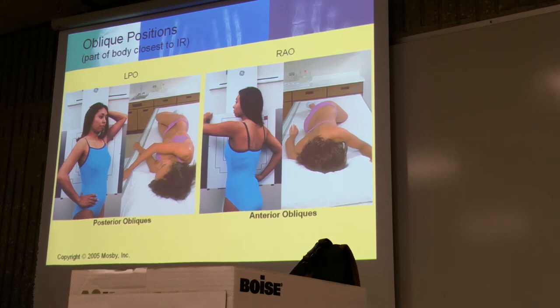There is no rule of thumb, but generally what we have done is we say the projection first and the position second. As a general rule, it's not always like that, but if you're not giving any type of descriptor, if you're just saying right lateral and then recumbent, you have to say whether you're talking about the projection or the position. You can do either one, but just make sure you're describing the correct terms. So I wouldn't just say right lateral.